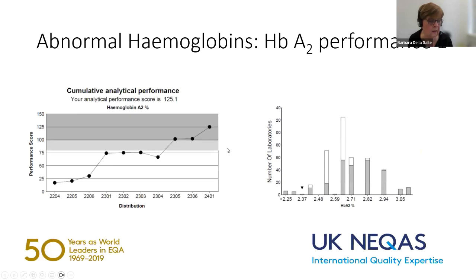then come down. One thing I would say about a high score is, once you've taken corrective action, it takes a bit of time for it to come back into the acceptable zone, and you shouldn't panic over that. As long as it is still coming down and the deviation index values are within the satisfactory zone, then don't take any further action, because the risk you run then is that you overcorrect and overshoot and you get your bias going in the opposite direction.